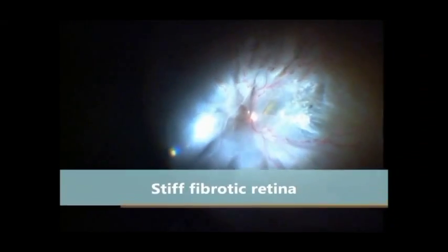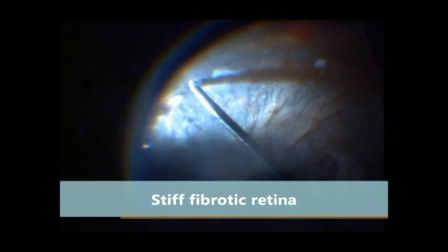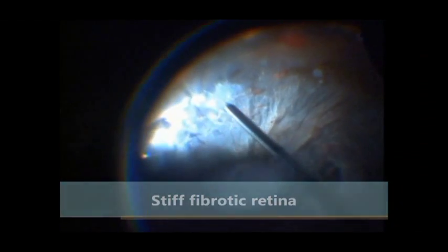This is yet another case of extensive fibrosis in which, in spite of a 360-degree retinectomy, the retina refuses to flatten.